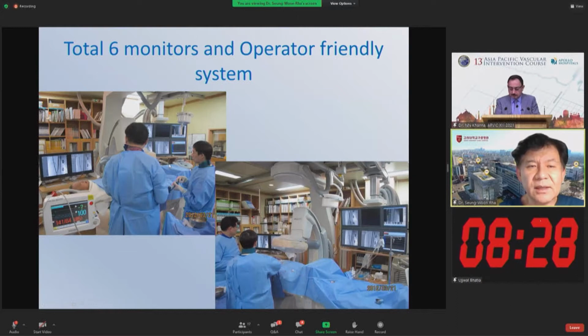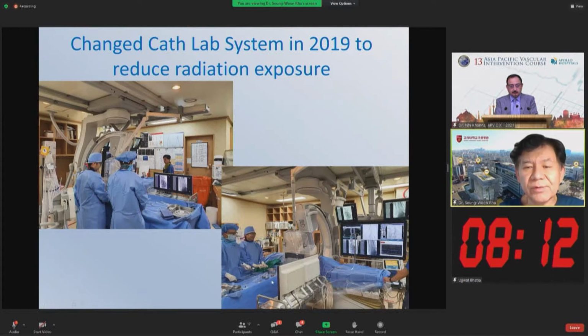I like these BTK patients because I do the simultaneous coronary work together, with the same monitor for the BTK and the SFA procedure. So in total we use 6 monitors. And this is the usual BTK direction. We are doing the BTK intervention like this.